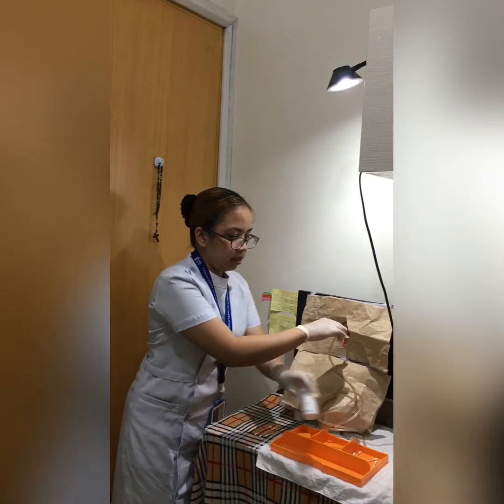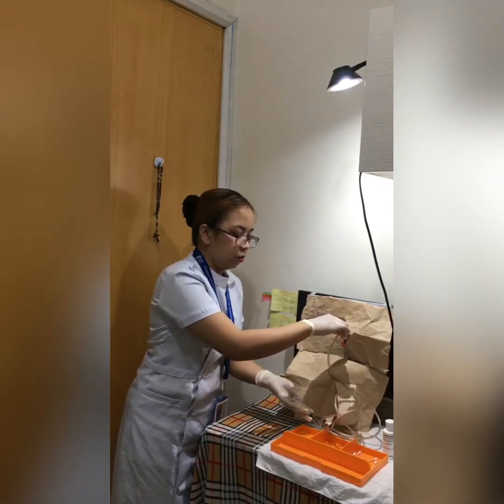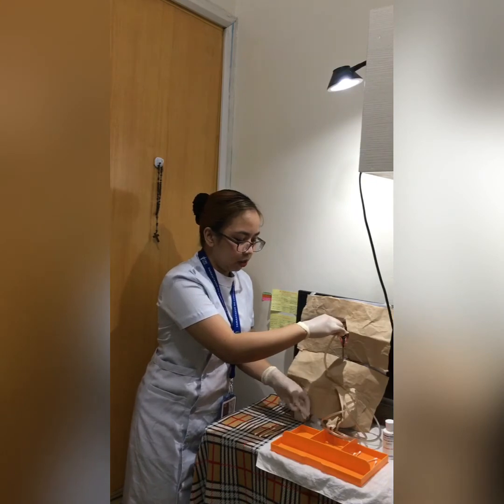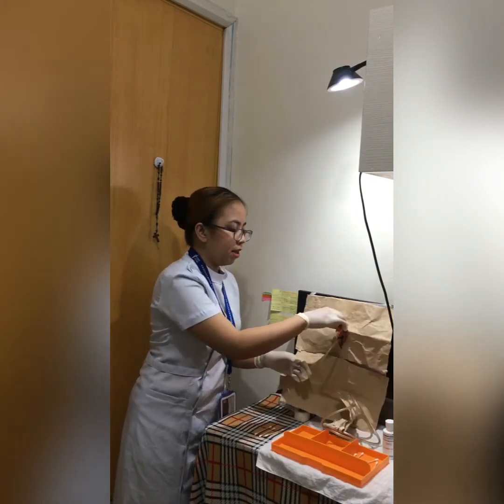After that we have to inflate the retention balloon when the catheter is already in the bladder of the client. Assuming that the balloon is already inflated.